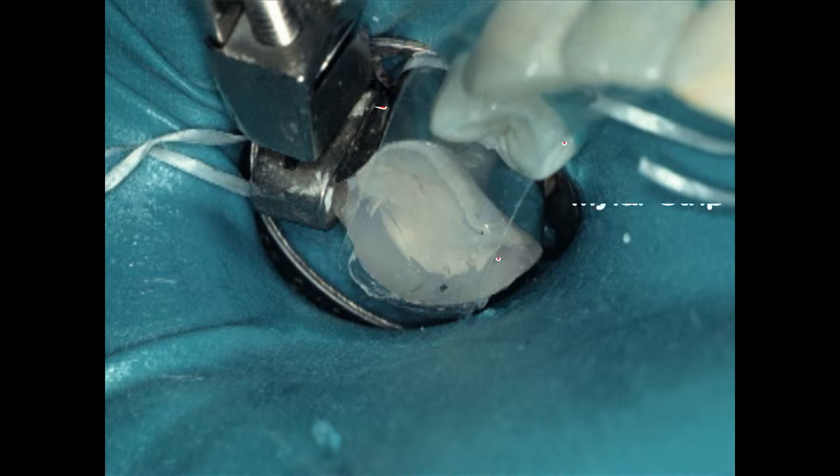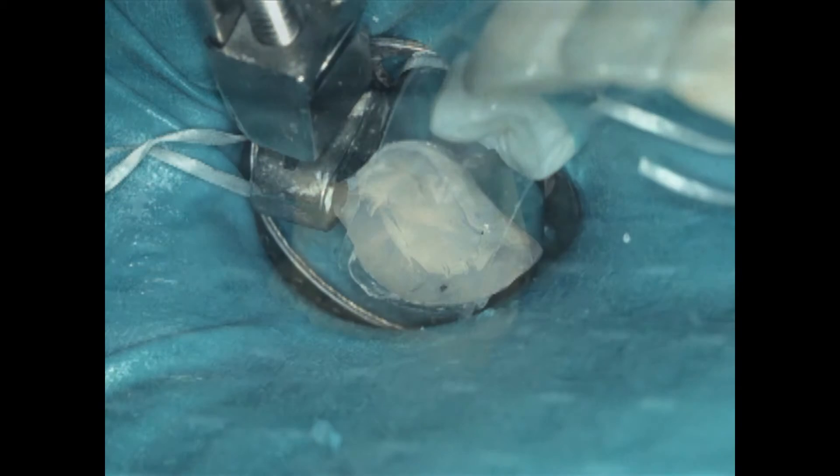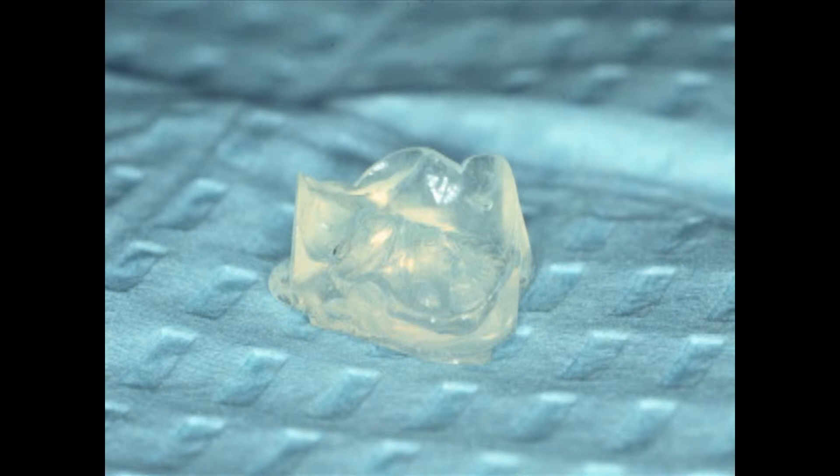To make it easier to cure through, I use a mylar strip — you can barely see it. I flatten the surface of unset bite registration material with the mylar strip. That allows the flat end of my light curing bundle to sit flat and put even pressure on this flat surface of the custom matrix as I cure through it. It also allows light to pass through more easily, and you can even see some surface detail through the custom matrix.